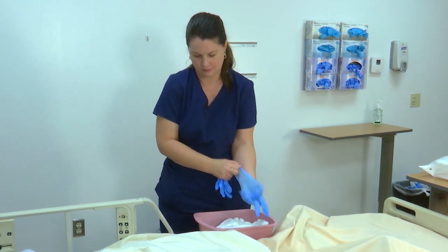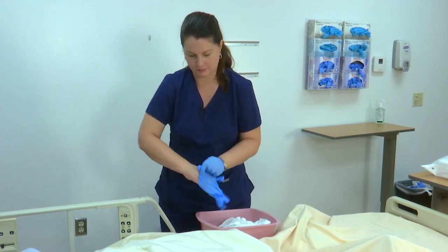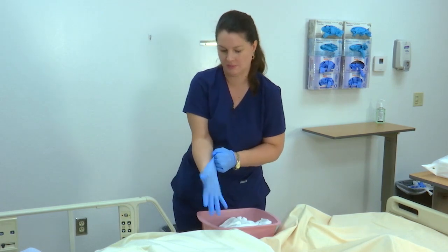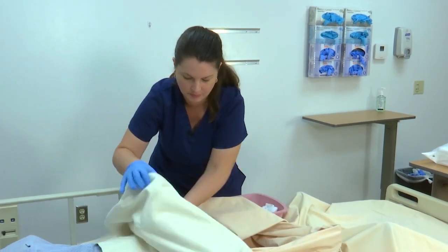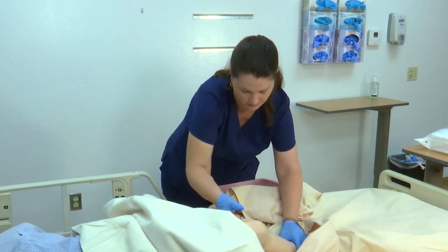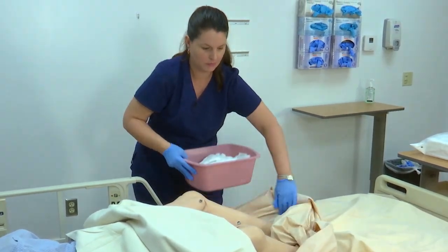Talk to the patient as you get ready to perform perineal care. Reassure her during this time as she may feel vulnerable. All right, Ms. Perez, I just need to uncover you a little bit here. Position the patient, typically by pulling the knees up. Drape the patient to allow for maximum visibility while maintaining privacy throughout the procedure.